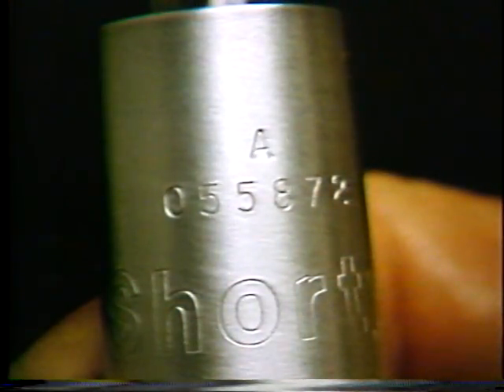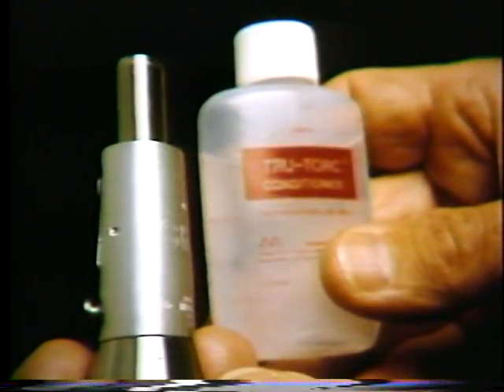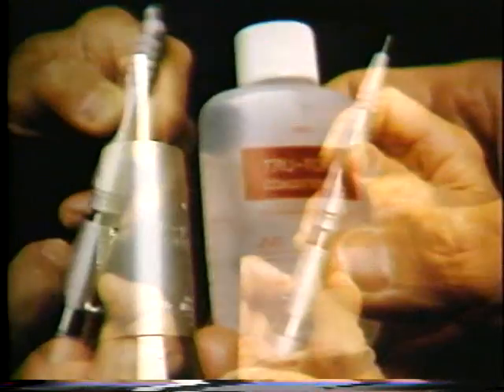Shorty motors stamped with an A above the serial number can be autoclaved with steam or chemicals. The motor must be cleaned and lubricated before and after autoclaving, and you should run the motor after autoclaving to make sure that it is working properly.